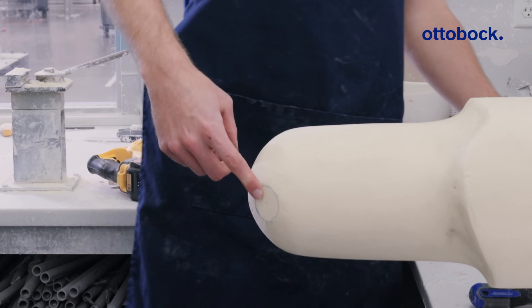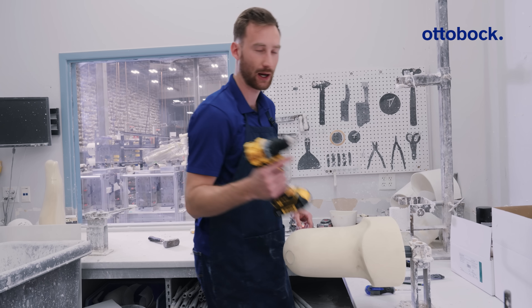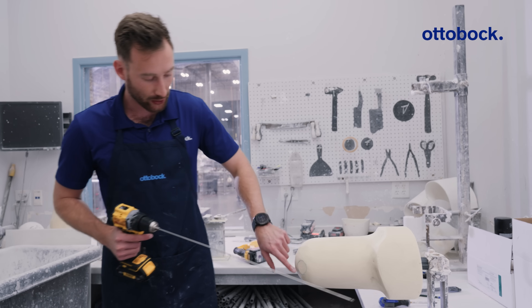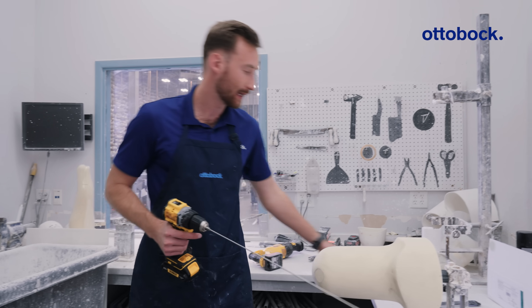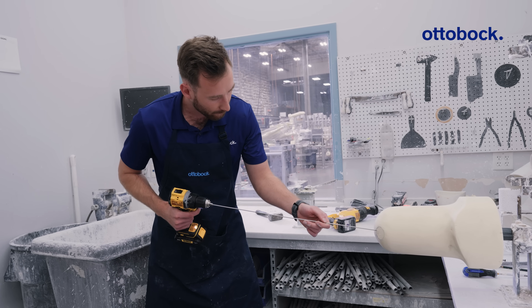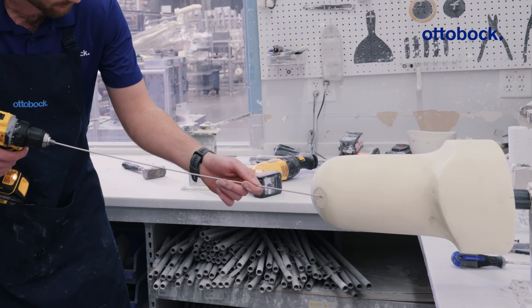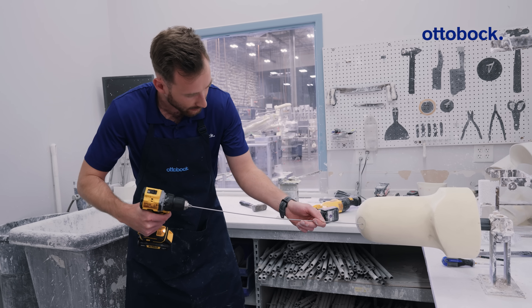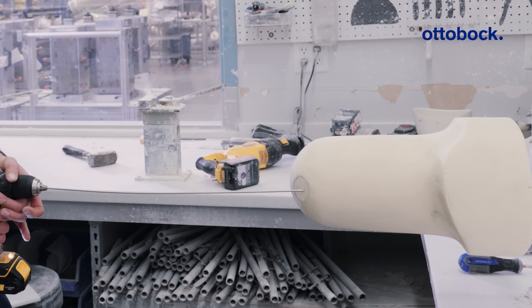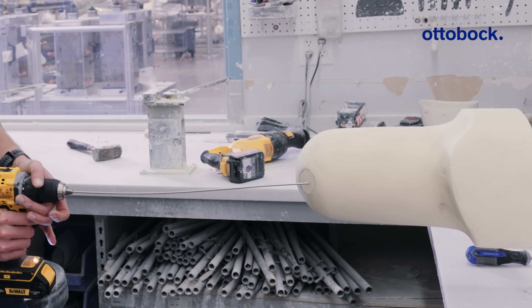As you can see, there we have our hole. The reason I do that is because I want to ensure when I drill up into the positive model I do not go through this hole, as it's the attachment point for the dummy. So I'm going to drill my hole above the attachment point of the dummy, and it's important that you get the correct angle to go through the top of the mold. Again, you can do the same thing with a plaster model — we're using foam today.